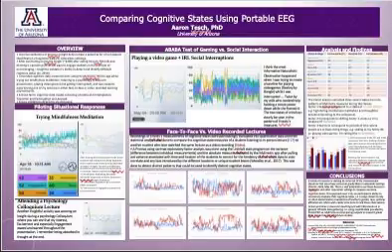So one of the things that they have all in common is that engagement, stress, relaxation, and focus seem to all correlate together. This kind of makes sense, because when we looked at the graph in my video game playing states, those are the measures that do indeed correlate together. They all went down together.